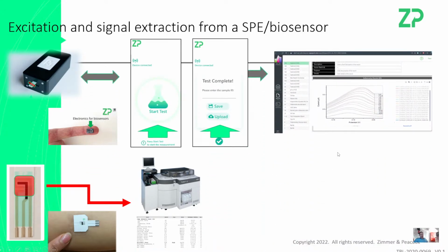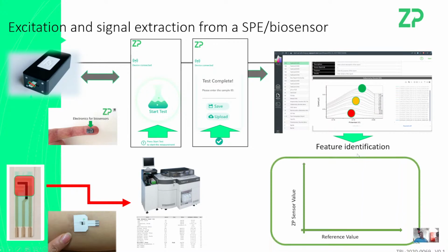So I end up with raw glucose values in my cloud, and I also end up with the value for my sensor and the truth. That means I can develop an algorithm using real data, comparing it against the clinical data. If I don't get a good correlation, we can look at the raw data and find a better algorithm until we get a better correlation with the actual clinical reader.